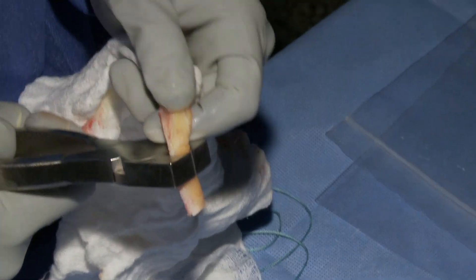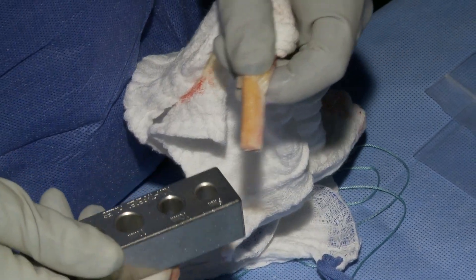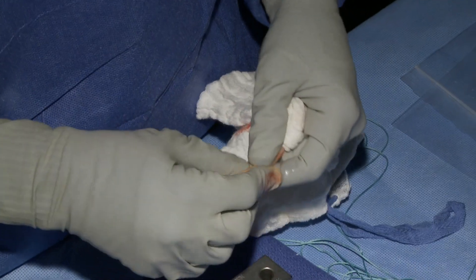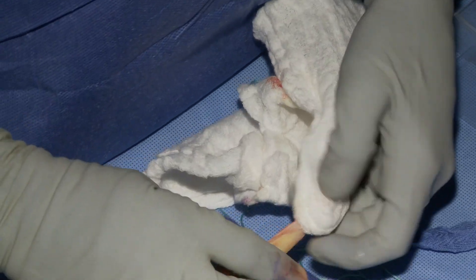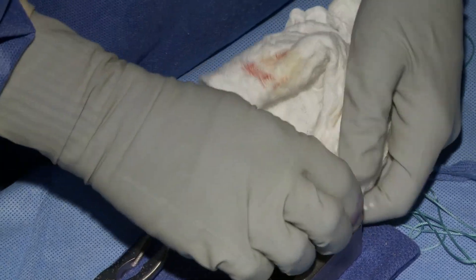The objective is to make each bone plug fit perfectly into whatever size tunnel the attending is reaming into the femur and the tibia. It cannot be too loose, and obviously it can't be too large or the graft will not pass.